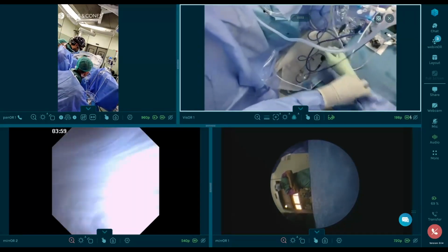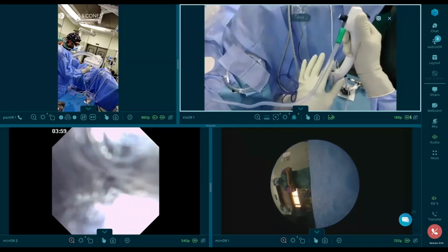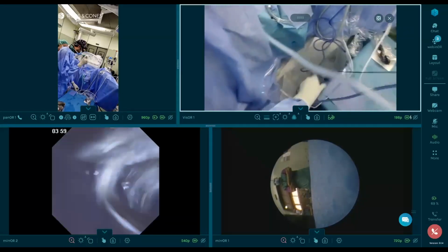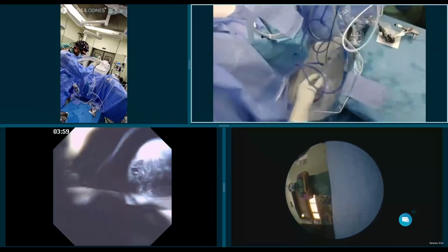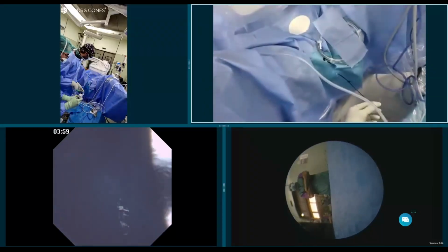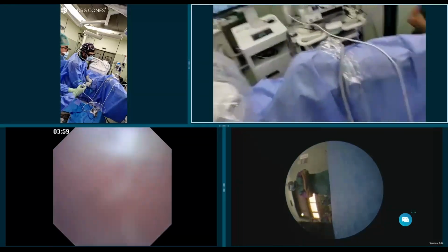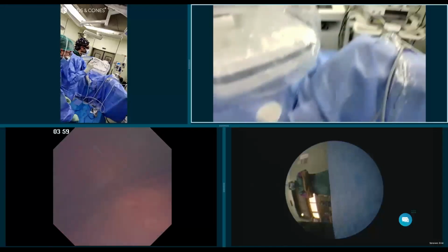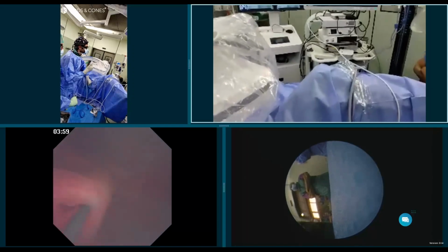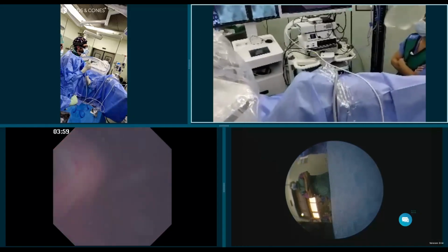Agree. So we have irrigation in the scope working channel. We put the aspiration. Remember that this is a 7.5 French scope, with a manual pump for my resident, sujeta acá. This is a 7.5 French scope and has a 3.6 French working channel, and the aspiration is on the same working channel as for irrigation.